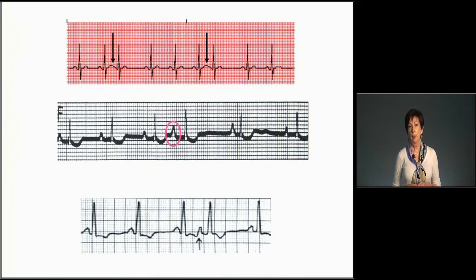I recall caring for a patient that was getting ready to be transferred out of the CCU, and she pretty much was having, most of the time, normal sinus rhythm, and we noticed that suddenly she developed frequent PACs. So we did the normal assessment, listened to her lungs, took her blood pressure, pulse, and lungs were clear. And her PO2 had dropped a bit. And that was the indicator that she was going into failure. Her chest x-ray confirmed that.